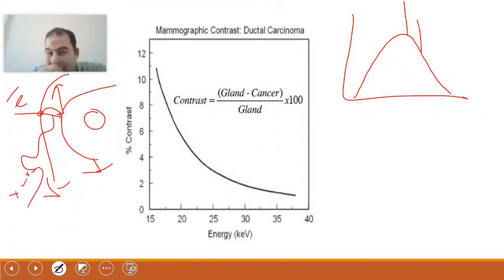Characteristic X-rays differ from tungsten to molybdenum depending on the type of material. Each material has its own specific X-ray. This depends on the binding energy of the electron in the shell to the nucleus. The stronger the binding, the higher the energy required to remove the electron from its position. The energy difference that is released manifests as X-rays, which I refer to here as the spikes that appeared, and I named them alpha and beta. Alpha refers to the electron that dropped from the adjacent shell, while beta refers to the one from a farther shell. So, it is always related to the electron in the shell.